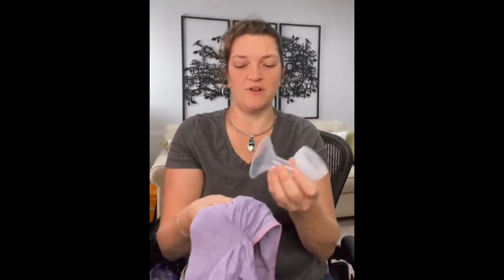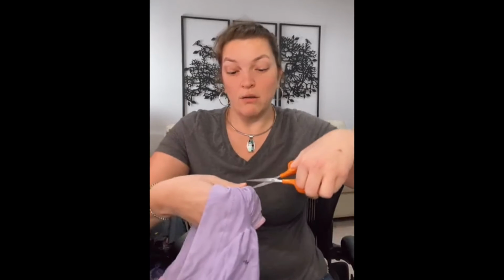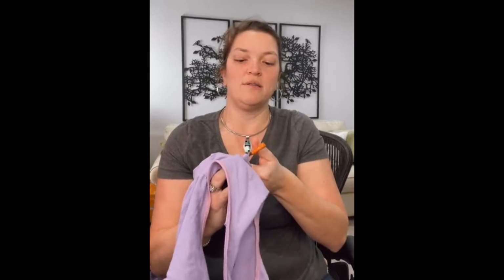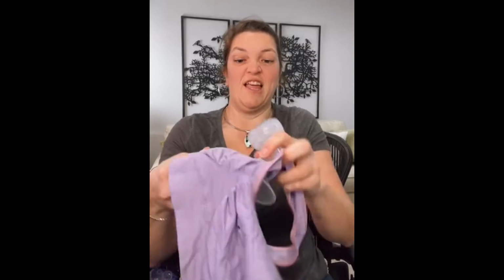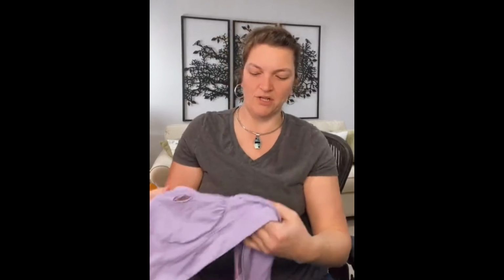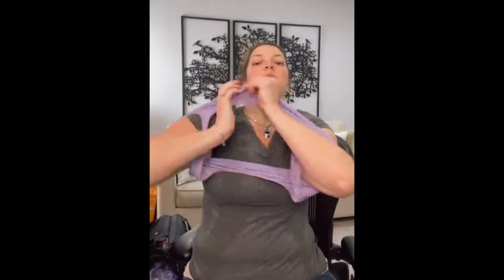So not quite big enough for a Spectra flange. I might need to make my slit just a little bit slittier in either direction, or you can also do like a little cross if you have a big Spectra flange. And again, you're trying to get it just big enough that that flange can stretch through but not be too stretchy. Okay, so then you're going to try it on. Now I'm going to do Spectra on one side, the Medela on the other side. So once you've got your little slit in there, you're going to put that bra back on and we're going to test it out, okay, and see where that lies.